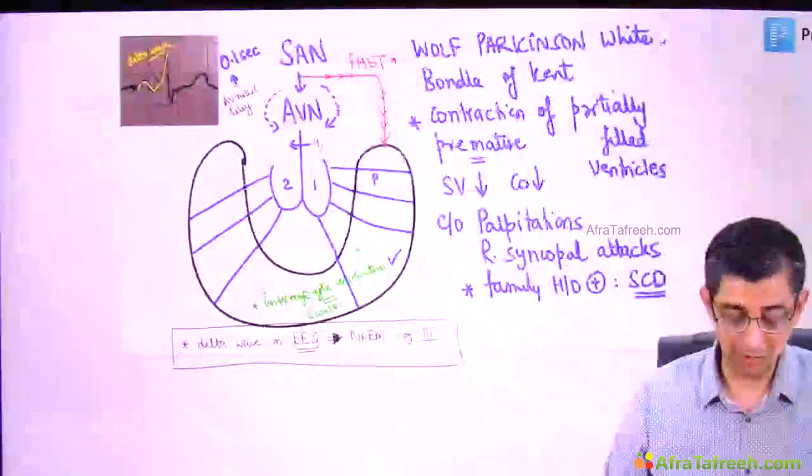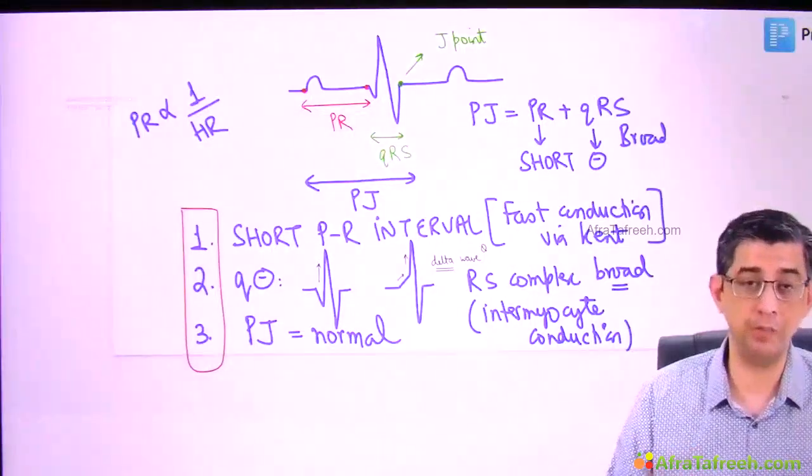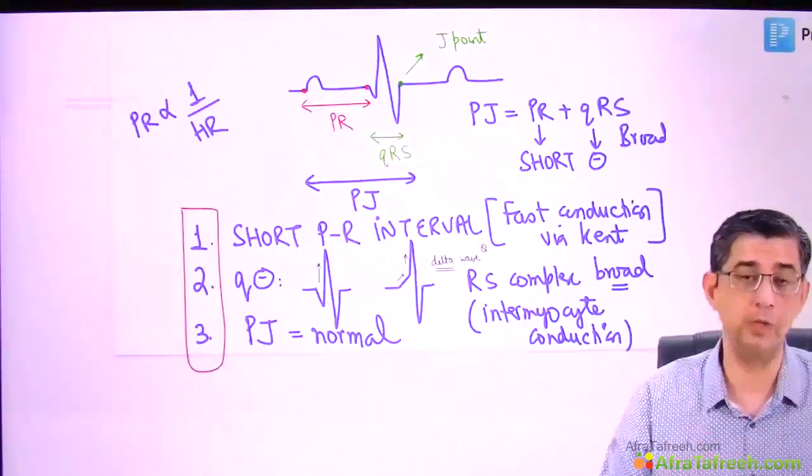And the objective of the current part of the discussion was to sensitize you to conditions which would be having a short PR interval. At the moment, we have discussed two of them. Both require radio frequency ablation, WPW and LGL.